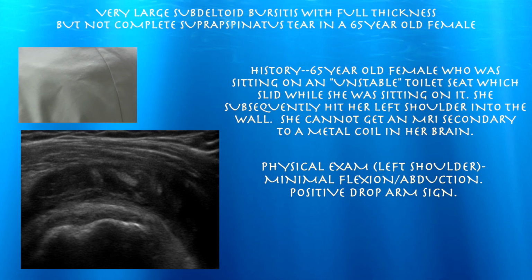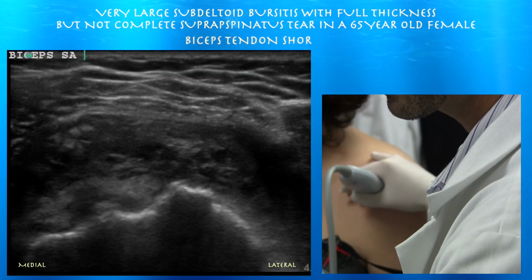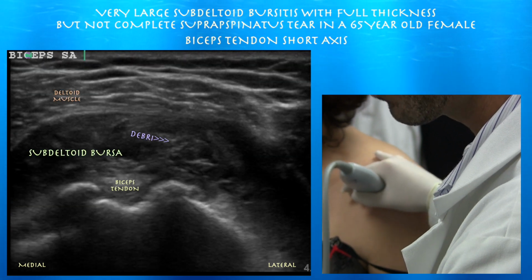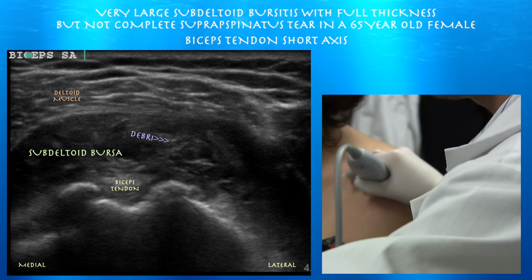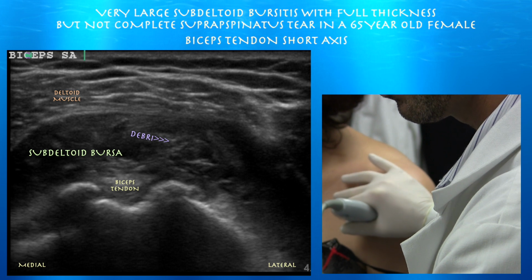I'm just going to do a little ultrasound here of her shoulder. We can see the biceps tendon here in the bicipital groove pretty nicely. But there's a very large overhanging subdeltoid bursa. You can see this heterogeneous mass above the biceps tendon, which is essentially an inflamed subdeltoid bursa. Pretty huge. This is all fluid, with a large amount of debris in this overhanging bursa.